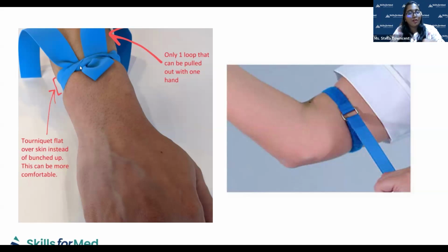Sometimes it is difficult to remove, and that's the part I have found, because before insertion we apply the tourniquet and figure out where the vein is, then insert the cannula, and then we have to remove it in the same way. The Velcro part is going to be tough, but still we are managing with this.